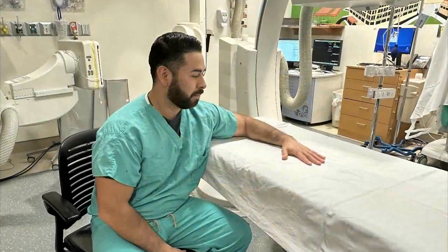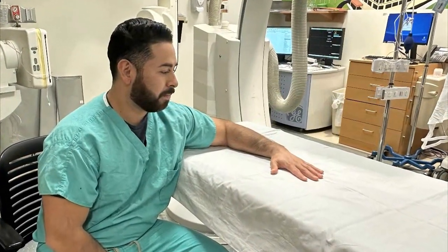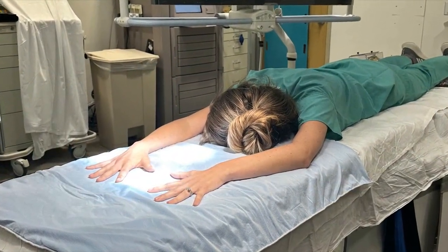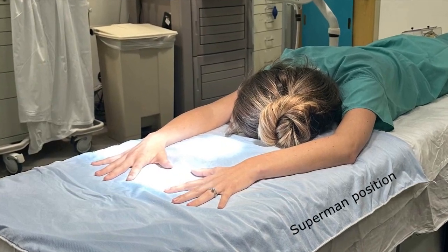Patients can either sit in a chair with their hand resting palm down on the fluoroscopy table, or they can be placed prone on the table with their hands held over their heads, again palm down in what we call the Superman position. I usually let the patient decide.